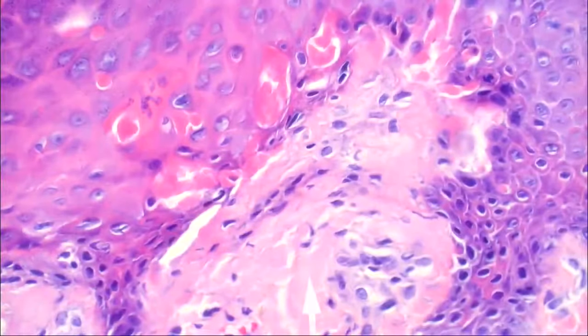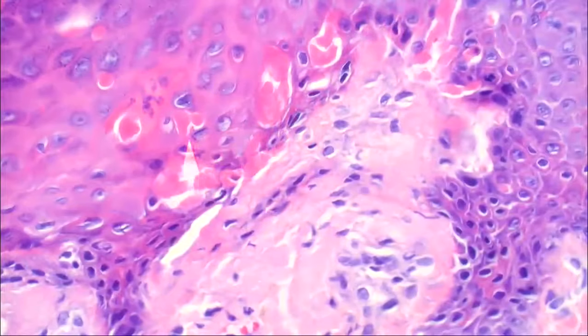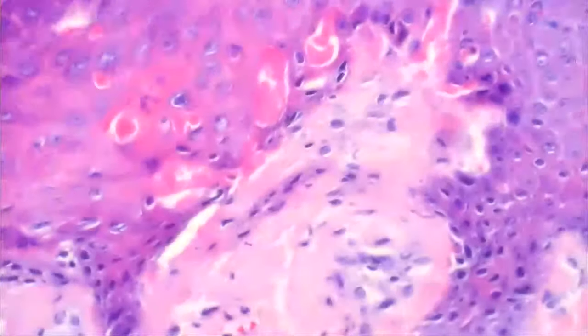This is derived from keratinocytes. Yeah, it's coming from these cells. So these cells are just degenerating, and eventually it deposits into this amorphous material. So this is amyloid that comes from the keratinocytes, a different kind of amyloid than the amyloid that circulates.